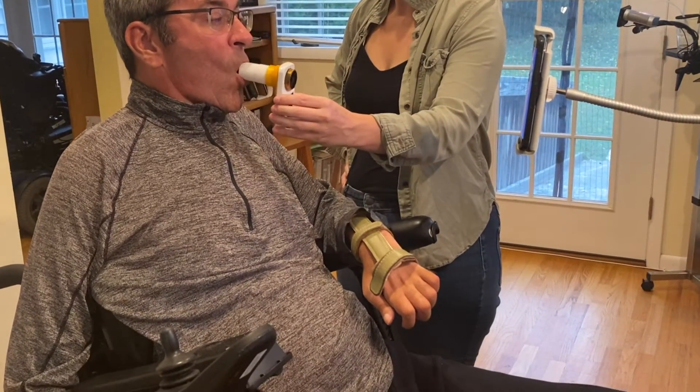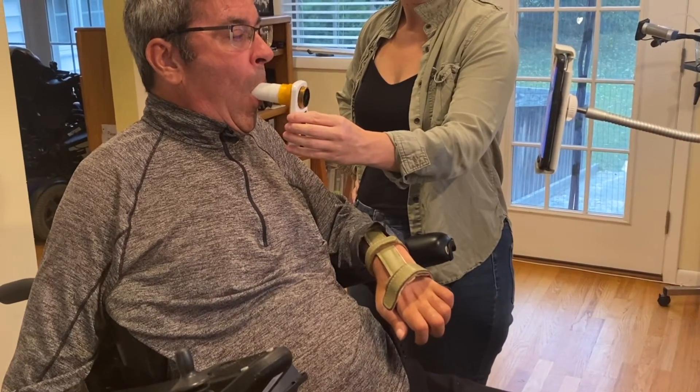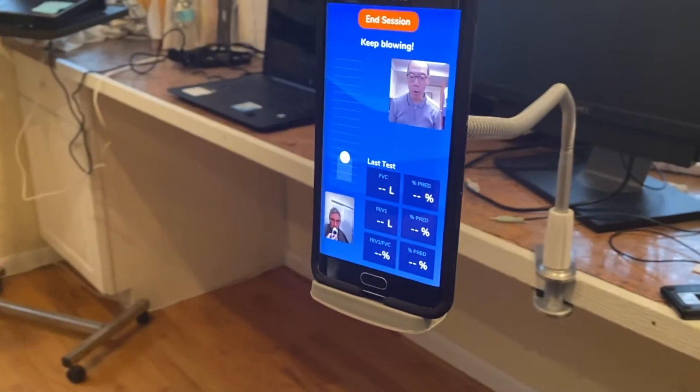Go ahead and put the spirometer in your mouth and take a big inhale, as big as you can. Really expand your chest, and when you're ready, blow it out. Blow it out. Keep on blowing, keep on blowing.